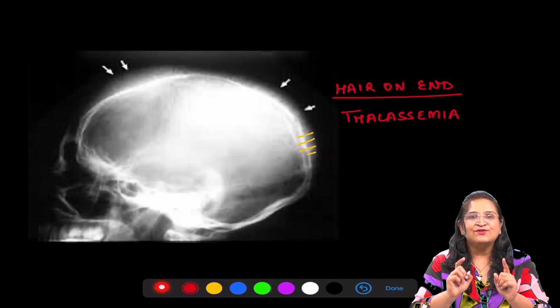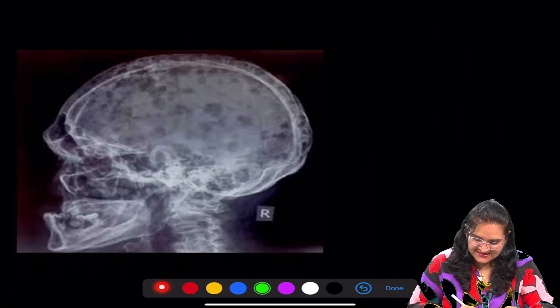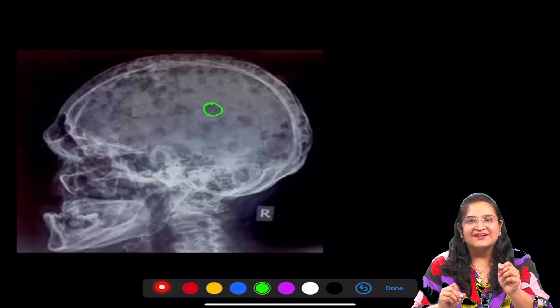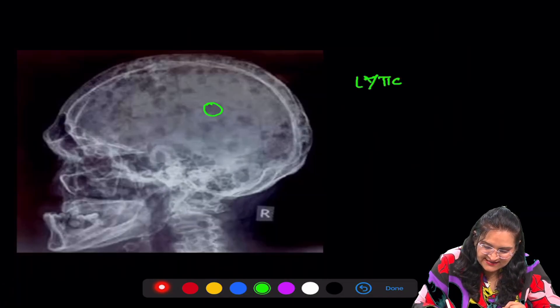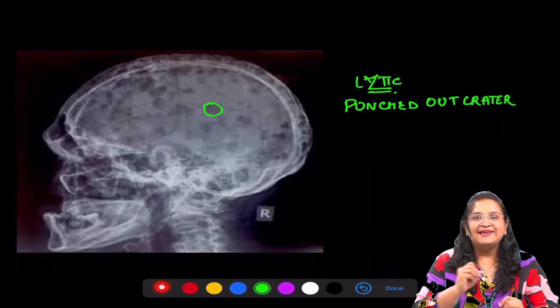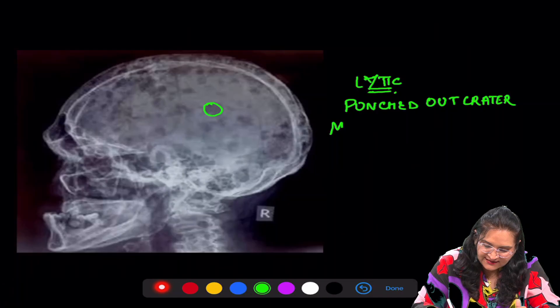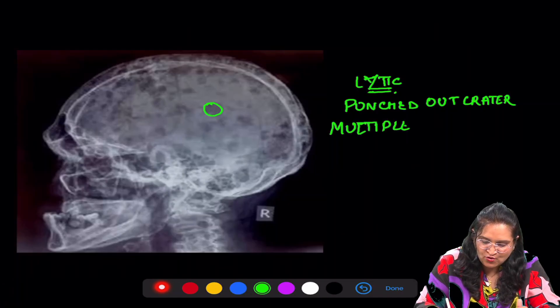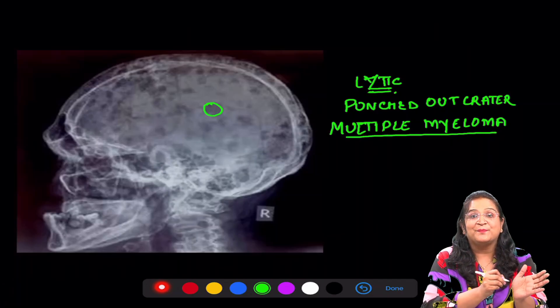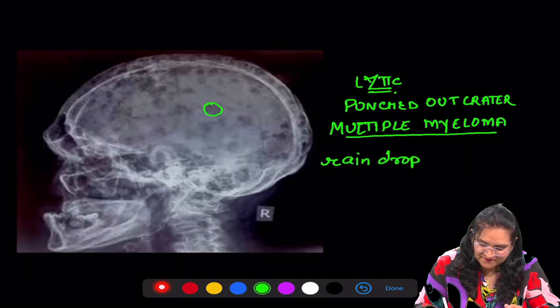Take a very good look at all the radiographs because these are sure to come in your exam. The next radiograph — can you see these well-circumscribed lytic lesions? These punched-out, crater-like lesions are characteristic of multiple myeloma, and this radiograph looks as if raindrops are hitting the surface.